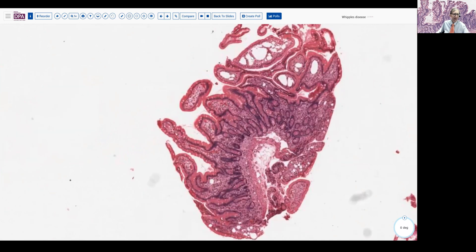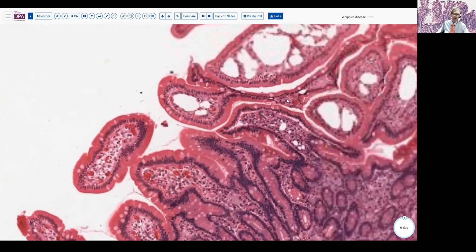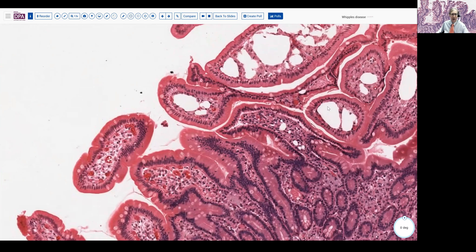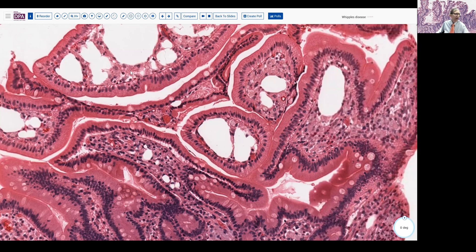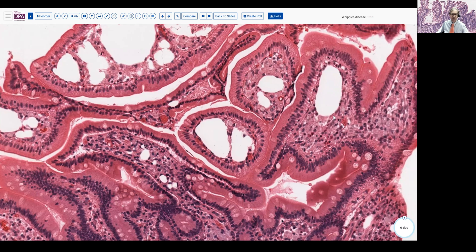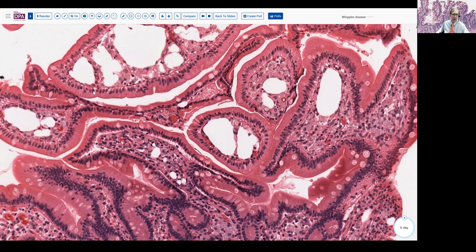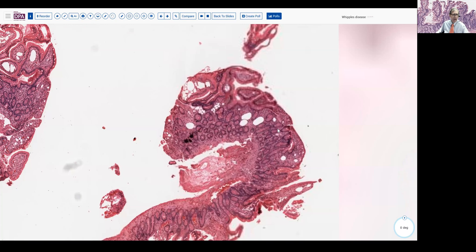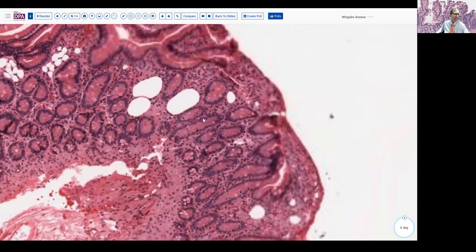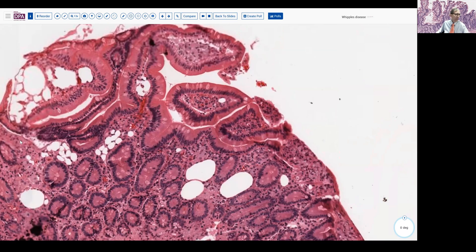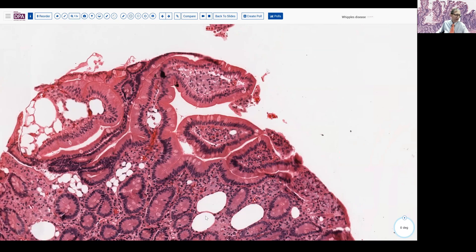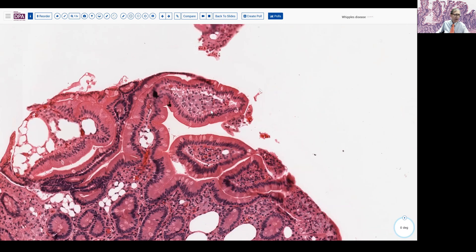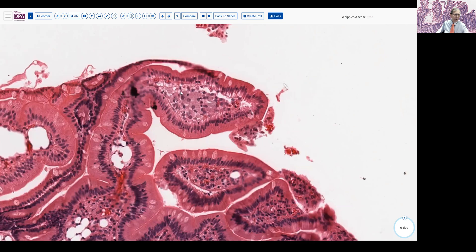Here we see a little bit of clear space and ectasia. Lymphangiectasis can be seen in a variety of situations. But looking around this as well, we notice there's some kind of foamy cells here — a little bit of histiocytic inflammation or infiltration in several foci. Looking at other fragments on higher magnification, here again we see this pattern of sort of pseudolipomatosis. Sometimes this can actually be due to the biopsy procedure, which may insufflate the bowel with a little bit of air and sometimes injects that into the mucosa. So this may not be lymphangiectasia — it may just be so-called pseudolipomatosis. But here again, we see a few clusters of slightly foamy histiocytes in this submucosa.